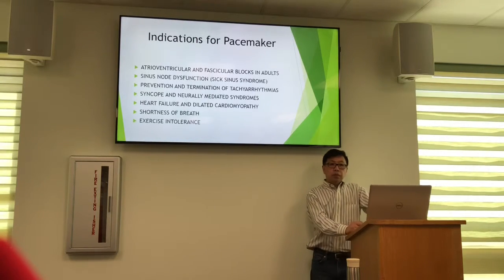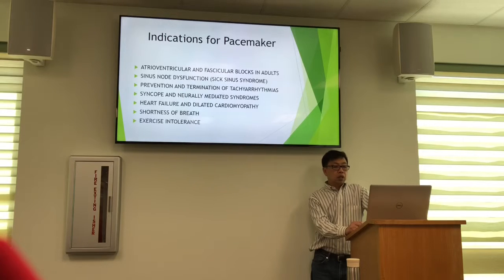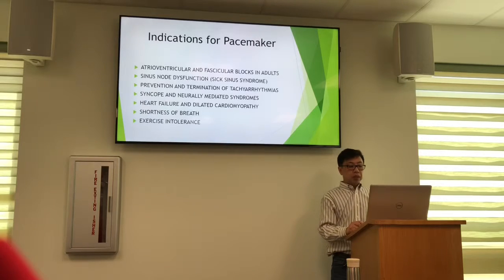Indications for pacemaker. Each year, pacemaker therapy is prescribed to approximately 300,000 persons worldwide. Currently, pacemaker devices treat bradycardia and tachycardia. In some cases, they are combined with an ICD, an implantable defibrillator, in older patients.